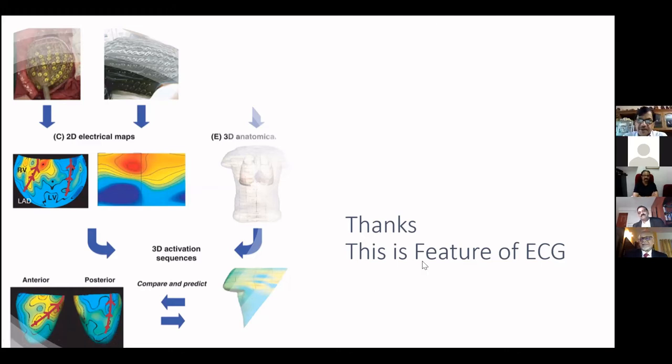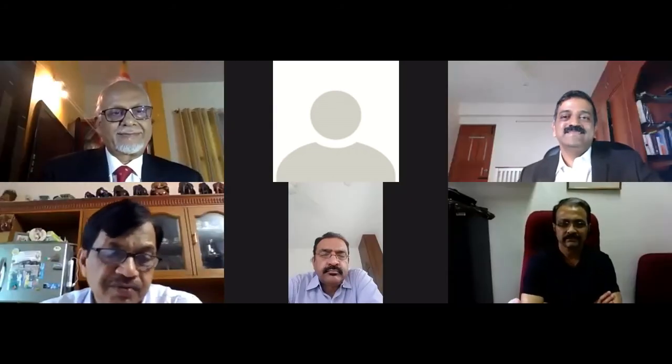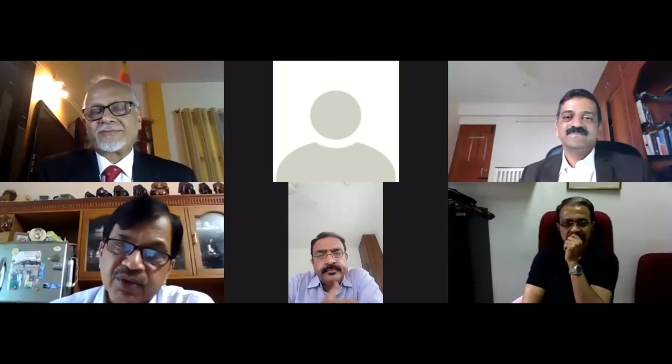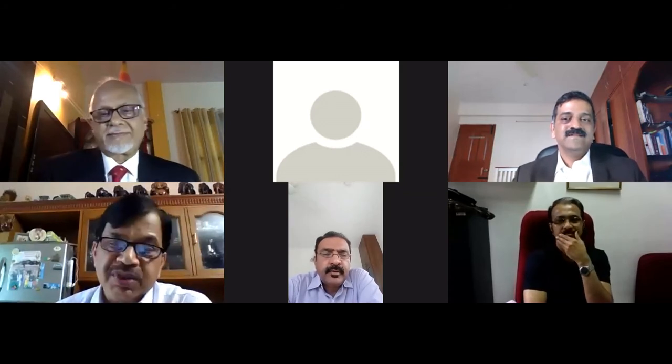Thank you, Prabhakar, for an excellent presentation. You have told all about possible ECG changes that you could see in the spectrum of ischemic heart disease. Also, you have mentioned how to go about localizing the culprit vessel. Now I leave it to Dr. Subhash to make a quick comment, and then we'll take up a few questions which are there.